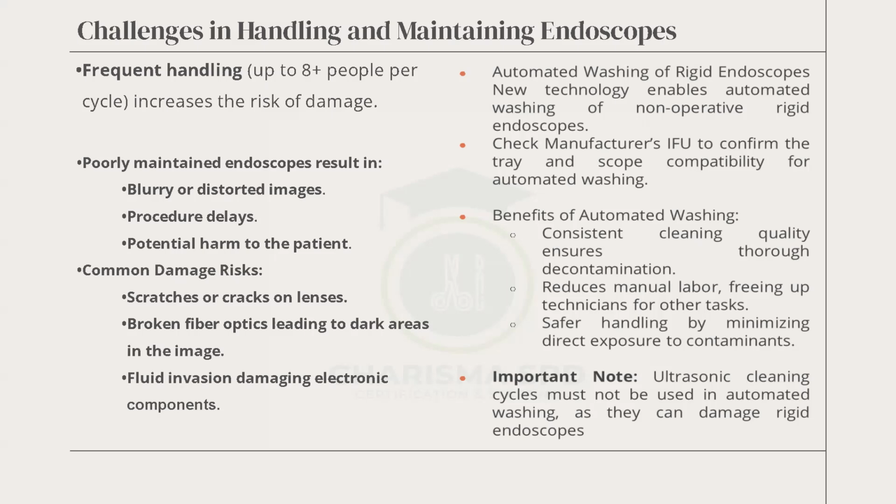So you have to clean the mirror to see your face well. Same thing applies to endoscopes too. Procedure delays, potential harm to the patient. Okay. Common damage risk: scratches or cracks on the lenses.